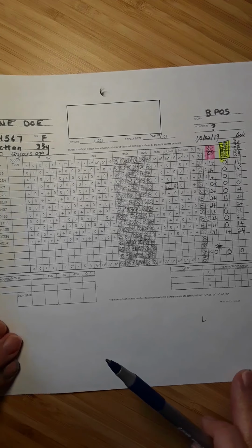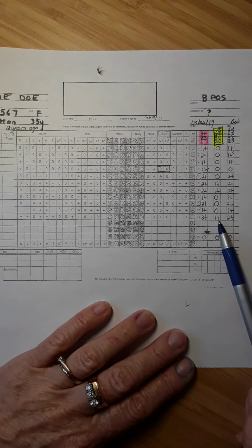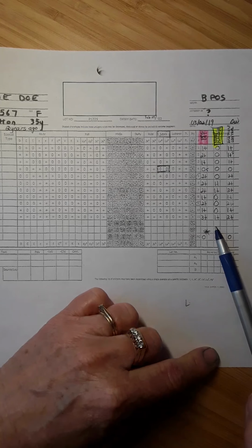So let's look at the next column in the results. So at the top here, it says neutralized plasma. Okay, so this is the plasma in which the neutralizing substance was added, and now we take a look at the reactions. Well, the first thing that I notice is that I still have some reactions. So I'm concerned then that there is another antibody in the patient's plasma. I also notice that I've lost a lot of reactions. So my hunch was right that the patient's plasma probably contained some Lewis antibodies that I was able to neutralize.